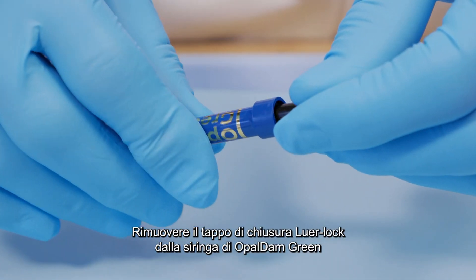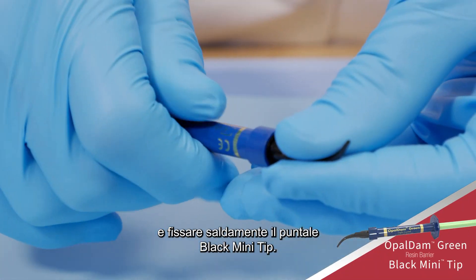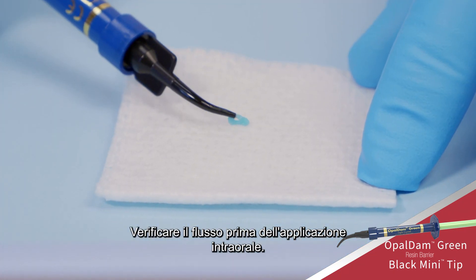Remove the LuerLock cap from the Opal Dam Green Resin Barrier Syringe and securely attach a black mini tip. Verify flow prior to placing intraorally.